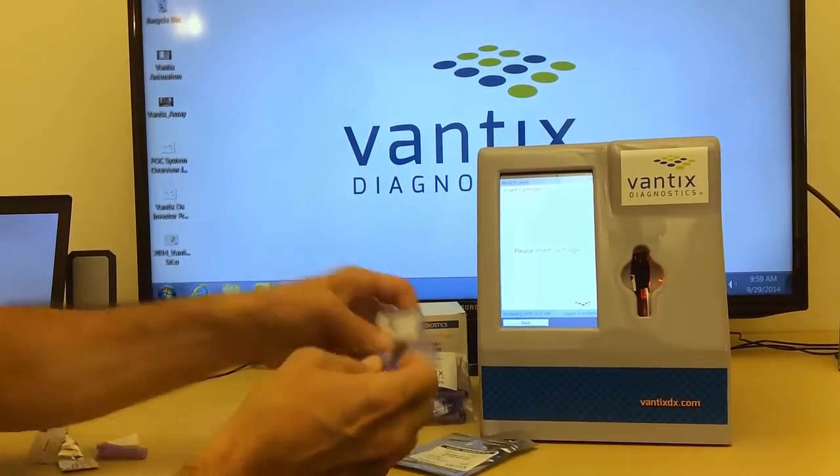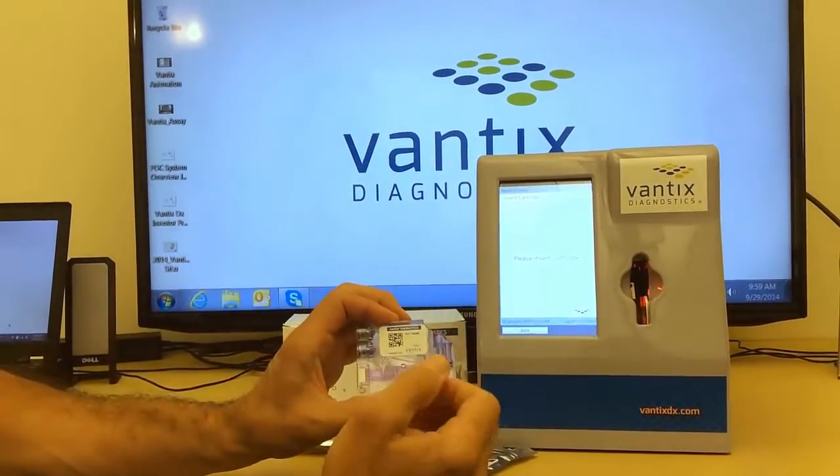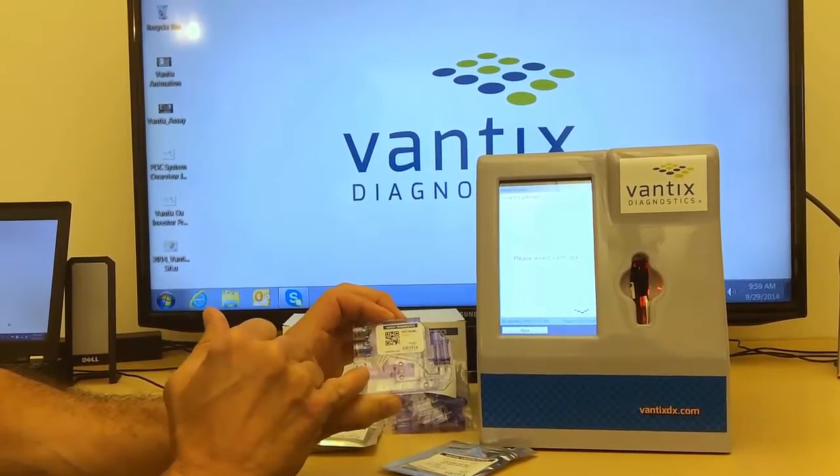The sample transfer device is then transferred to the single use cartridge. The cartridge now contains the sample, the reagents, and the biosensor.